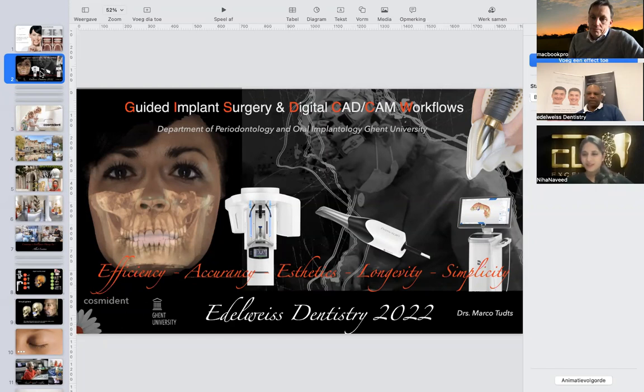Yes. Thank you, doctor, for answering all these questions patiently. We just have one last question. How does the Edelweiss block react against a normal tooth, a normal crown, and an implant crown? Okay. How does it react to a normal tooth? Very well, because it has the same hardness in wear as enamel. That's the reason why it acts very well on a normal tooth.